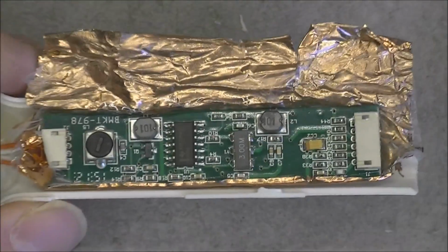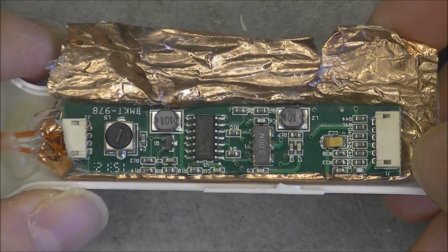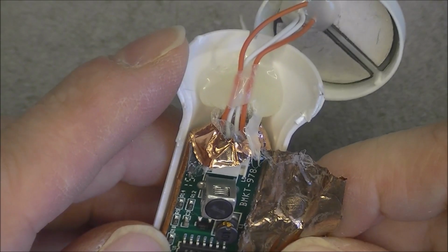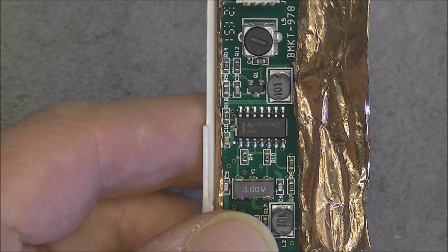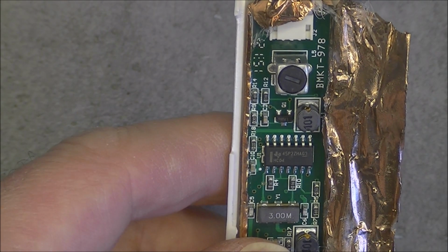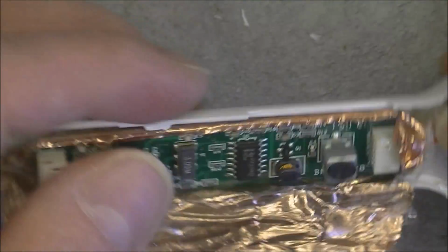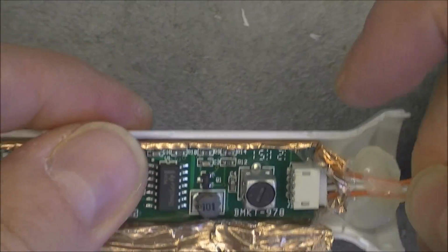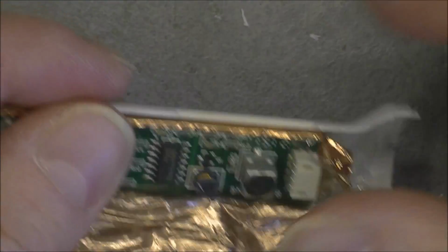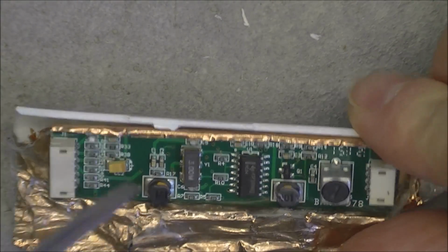Apparently I can see a 3 MHz oscillator here. Some TI chip here. 45P2ZHAG3, it seems, and just a few passive components. The probe wires can be disconnected at this level. And now with the foil open, I should be able to remove completely this PCB.